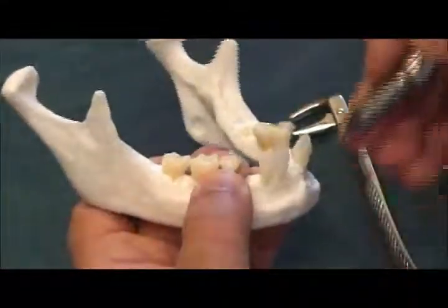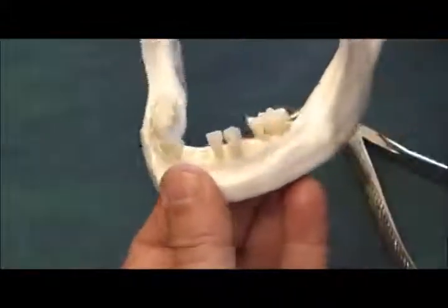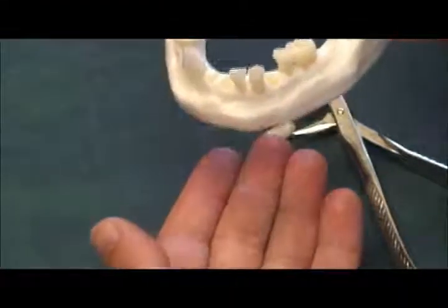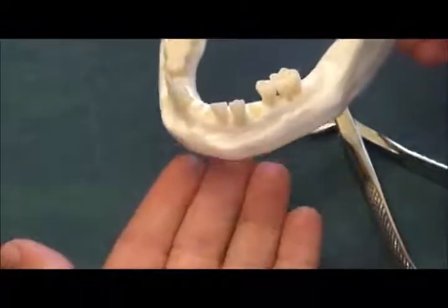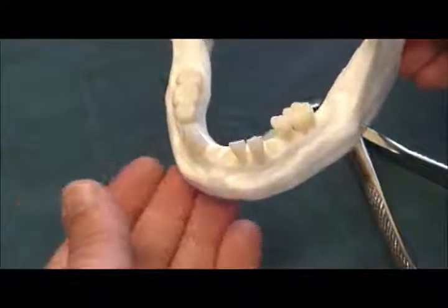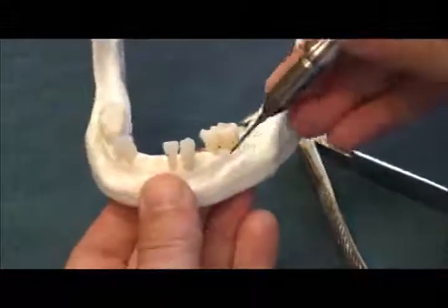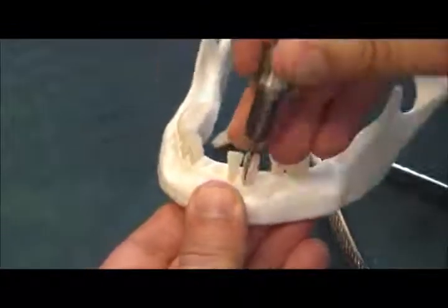I want to go ahead and we'll take out another tooth on this side. Just to illustrate another thing, in the maxilla, of course, you're not going to have to support the patient, but in the mandible, when you're using the powertome, you want your hand or your assistant's hand directly under the tooth you're working on. You don't want your hand over here if you're working on a lower left tooth. But I'm going to come up on this canine tooth here, and I'll start off on the mesial facial here and applying power.